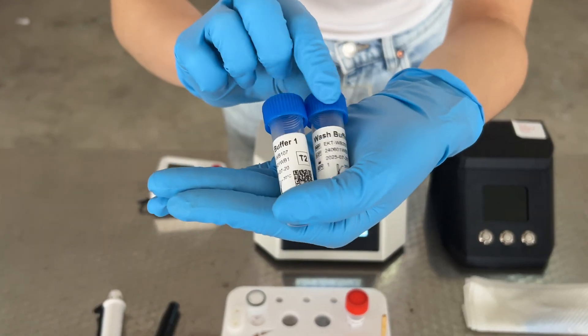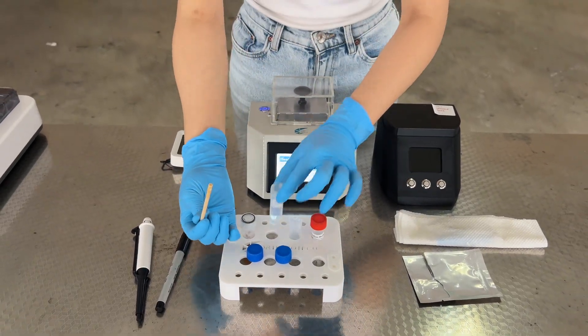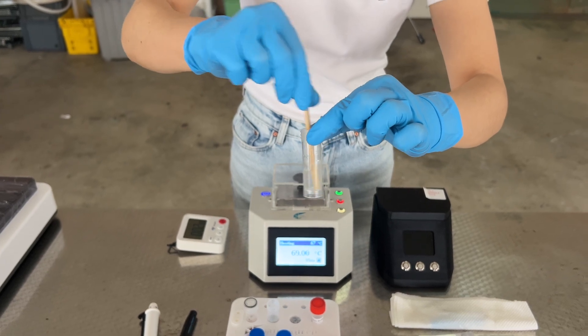Prepare wash buffer 1 and wash buffer 2. After the 2 minutes are up, take the stick and whisk vigorously in washing buffer 1 for 12 seconds, followed immediately by washing buffer 2 for 12 seconds.